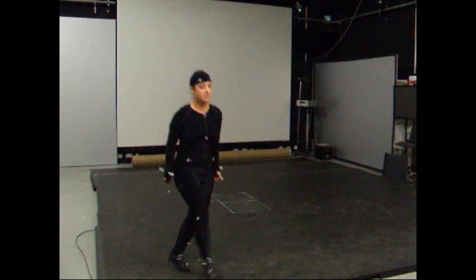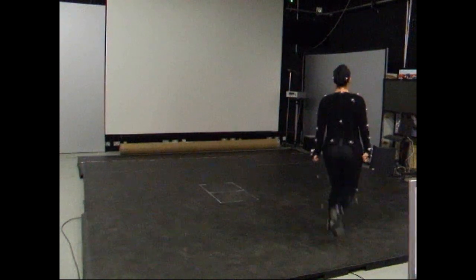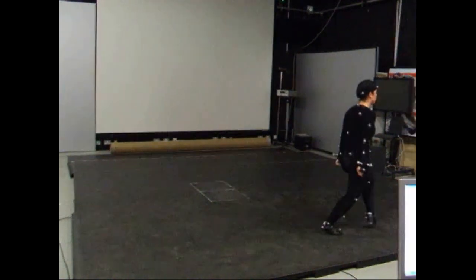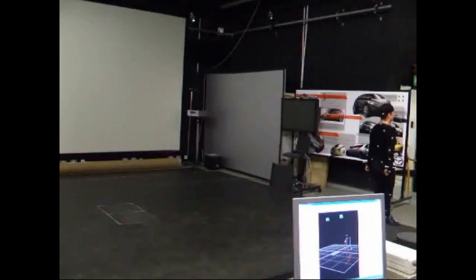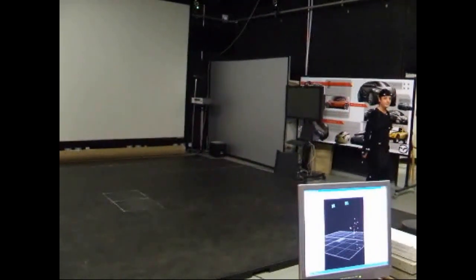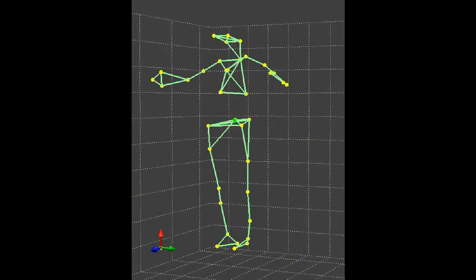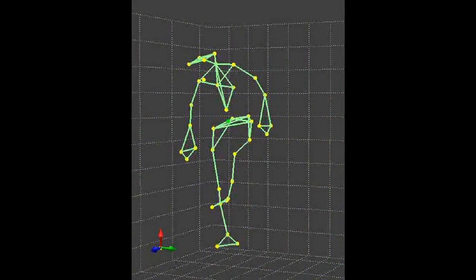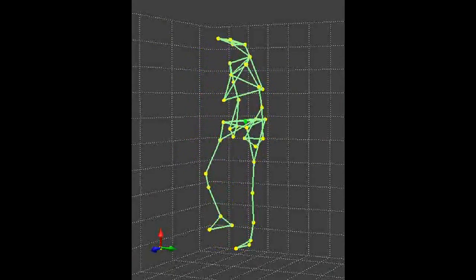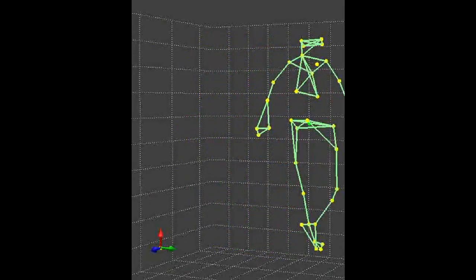We then ask the subject to undertake the motion that we want to measure in three dimensions. The cameras don't actually see the subject at all — all they see are the markers that are attached to the subject. They're not actually photographing the image; they're actually measuring the locations of those markers.